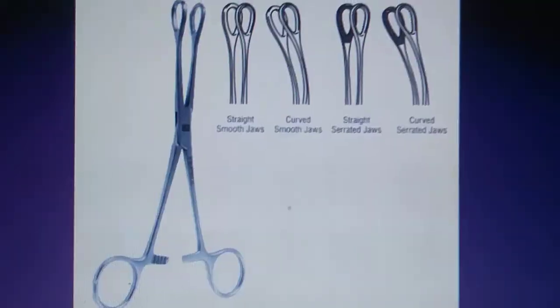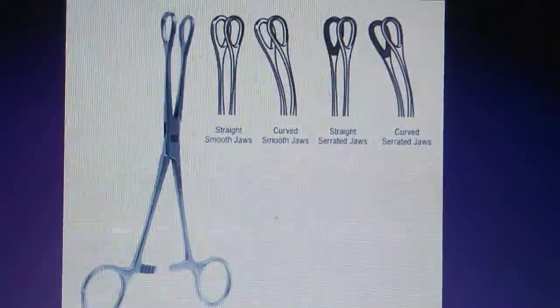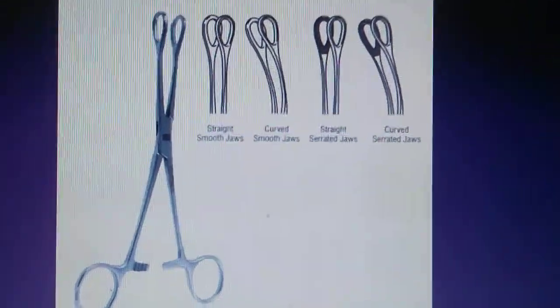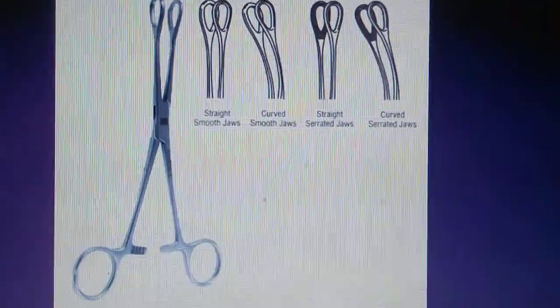The sponge holding forceps are for grasping, holding, and mobilizing surgical dressings, and for soaking up excess fluids.